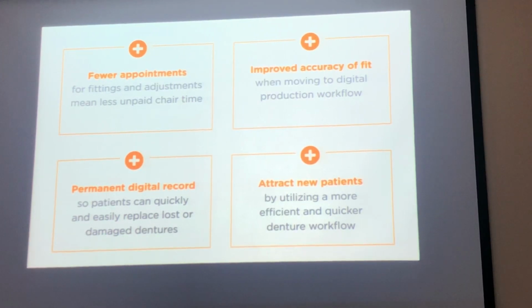And then they design in the software, in the CAD software. It's possible to arrange and set up the denture teeth on the software. After that, they will transfer or export this file to the milling machine to mill the denture base for you. And in some systems, it's possible to mill the denture teeth as well, or you can use stock denture teeth.